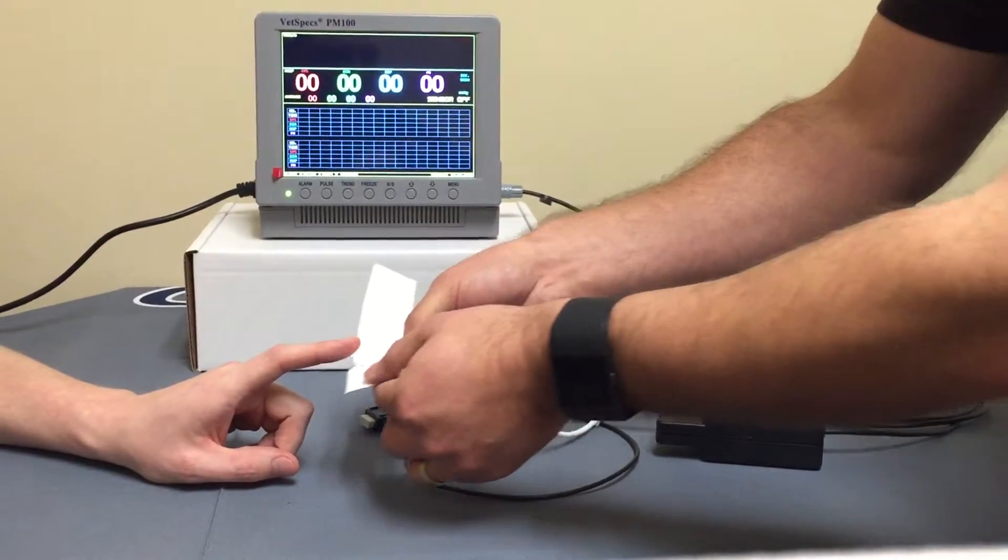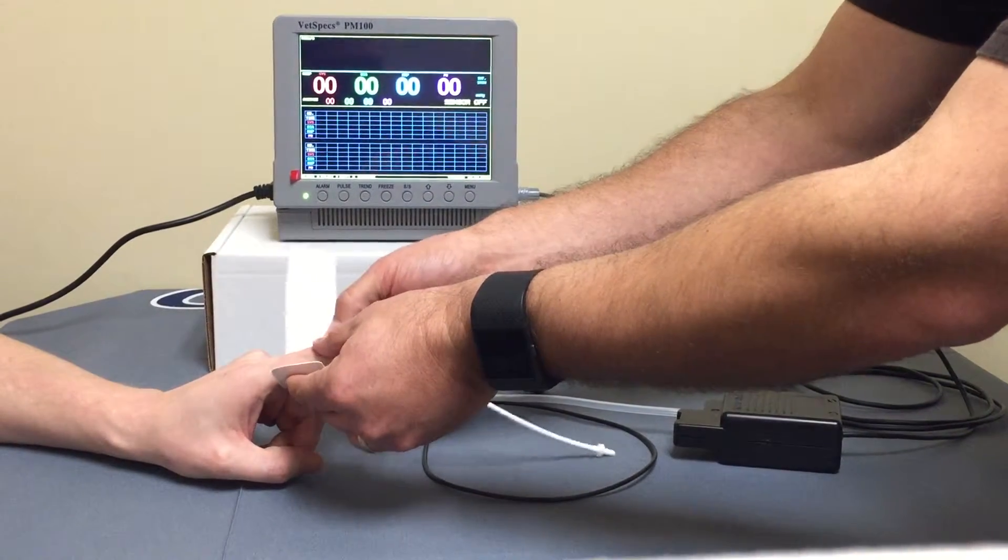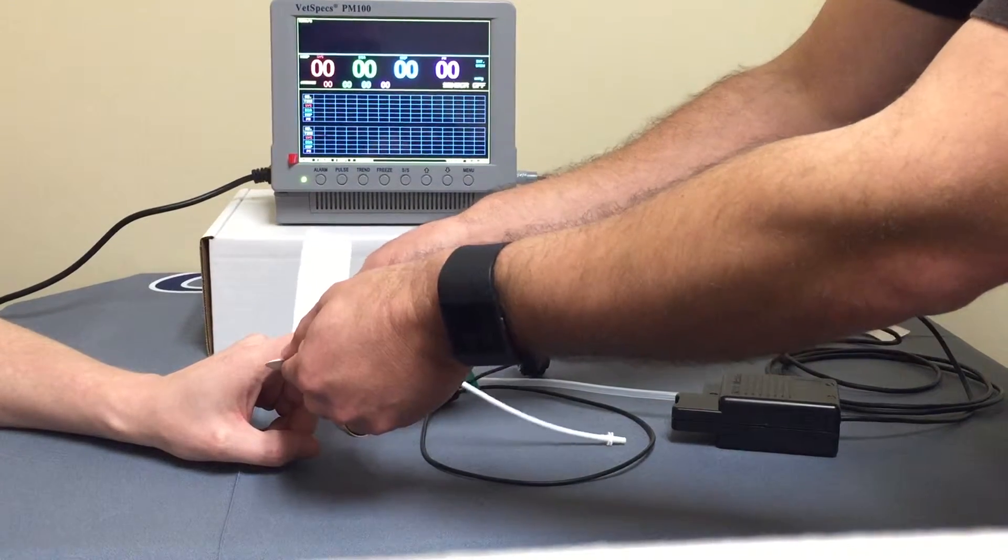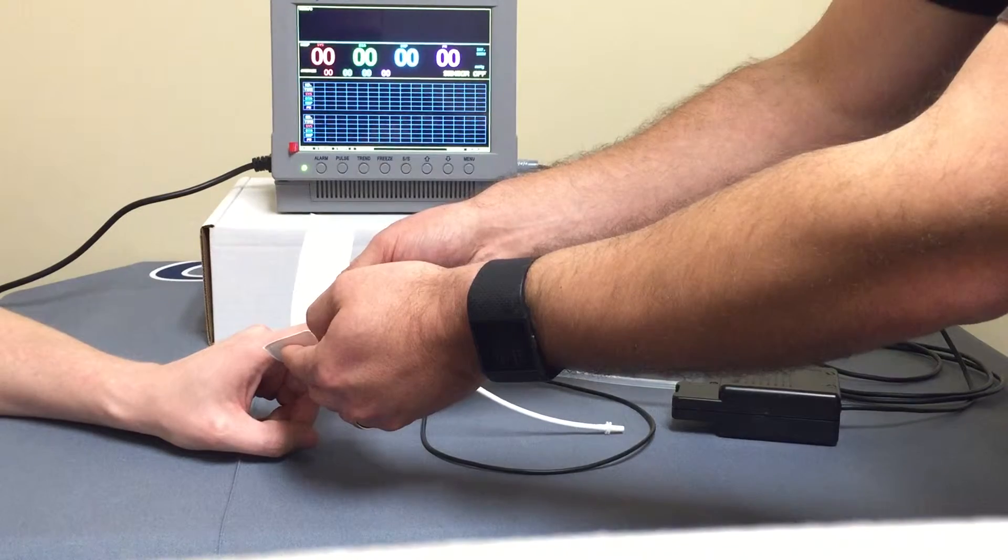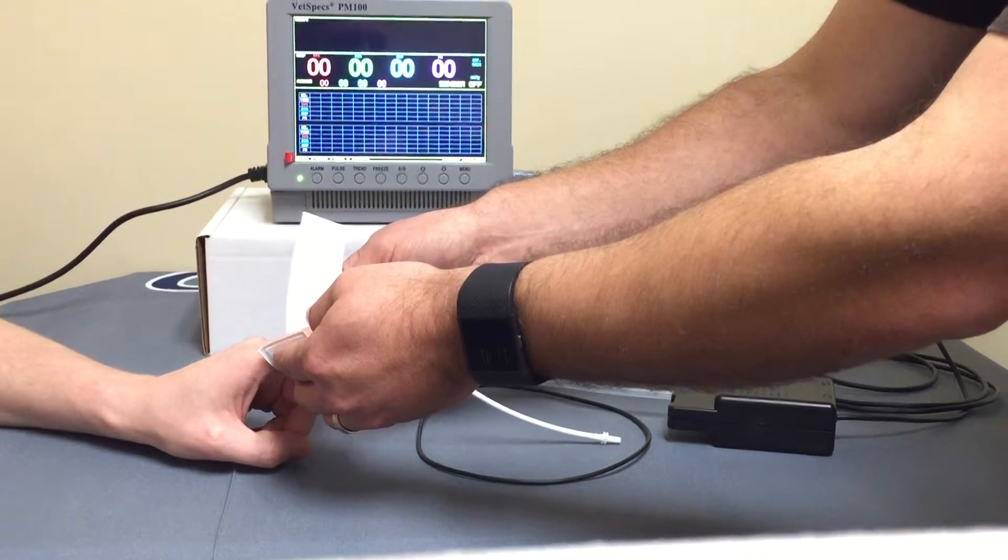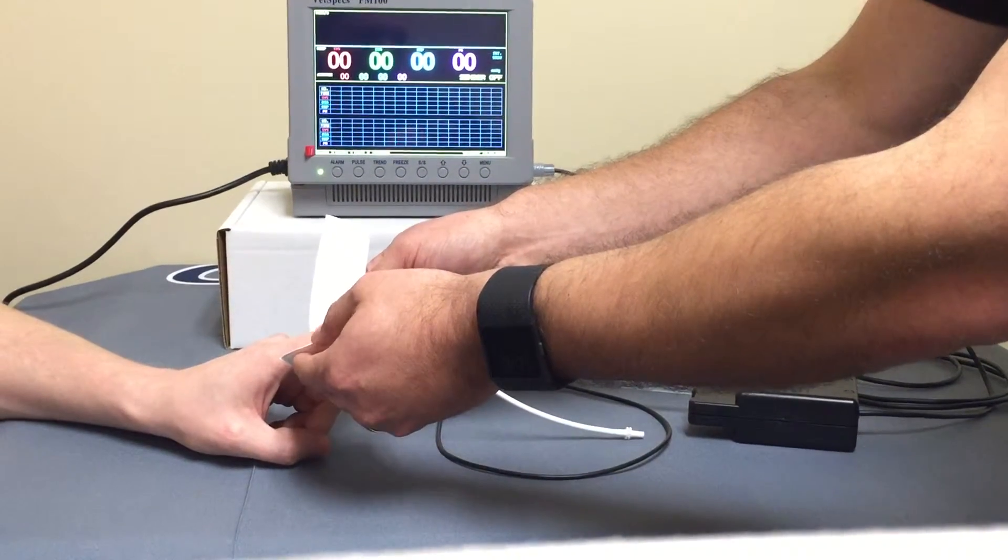Make sure again the word artery is over the artery in the limb. On the human finger, of course, the artery is going to run on the ventral aspect. That is actually just like that of a cat or a dog's tail, so this will be really a good example of how you'd hook up a cat or a dog on their tail, which by the way is an excellent location for this blood pressure technology.